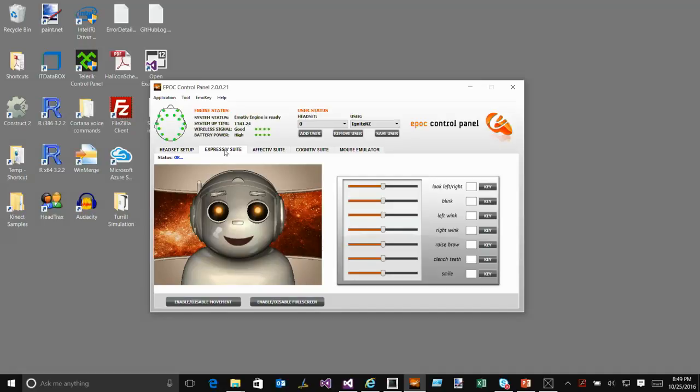So I have not trained this one for myself, but let's see if we can get this. I'm going to blink my right eye. I'm not looking up there. Is it working? And then blink my left. Yes, yes. Okay.